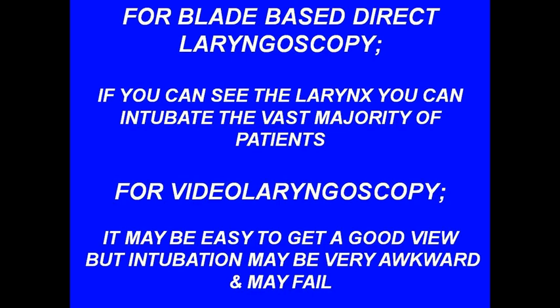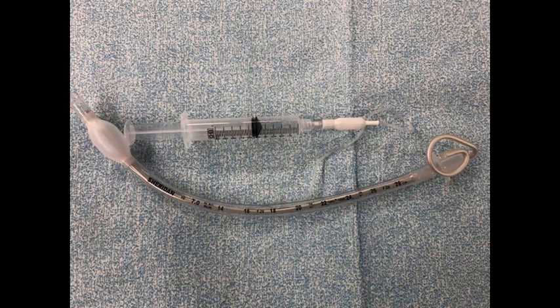With conventional direct laryngoscopy using a Macintosh and Miller blade, if you can see the glottic opening, you can nearly always get the endotracheal tube to pass through the glottis. But with video laryngoscopy, such as a GlideScope, it is common to get an excellent view of the larynx, but have difficulties in advancing the tip of the tube to the glottic opening.